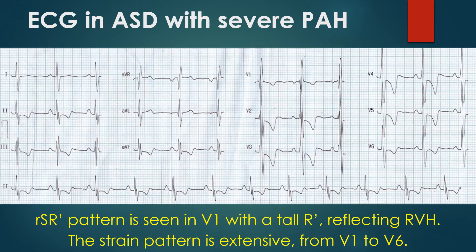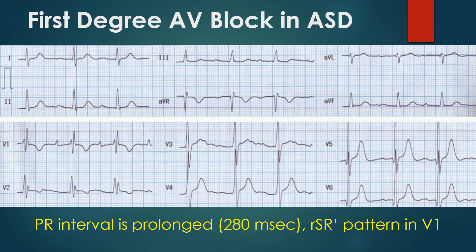RSR' pattern is seen in leads 3 and AVF as well. An additional S' wave in leads 2 and AVF and notching of the downstroke of the R' in lead 3 suggest fragmented QRS per new terminology. PR interval is prolonged and measures 280 ms. There is also incomplete right bundle branch block with RSR' pattern in V1 and a QRS width of 110 ms.